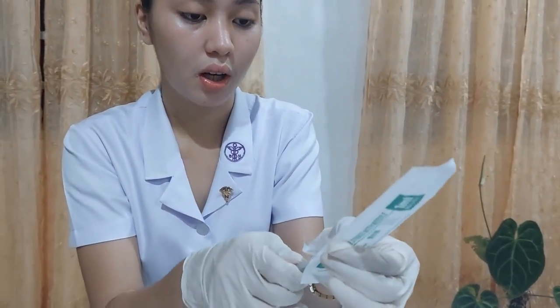I think we're good here. So now I'm going to uncap the needle. Okay, so I'm just going to leave this here. And now I'm going to draw up air into the syringe, the same volume as the medication that is to be withdrawn. Going to be at the 0.4.